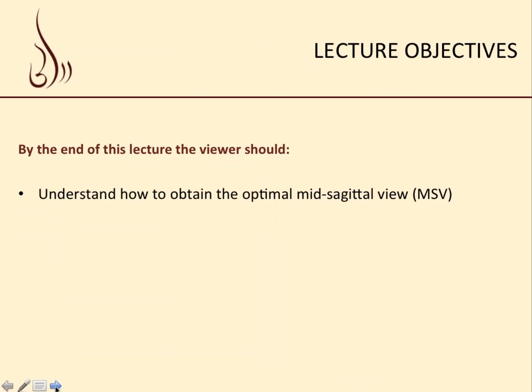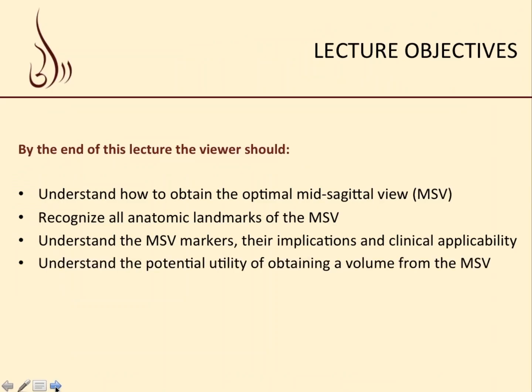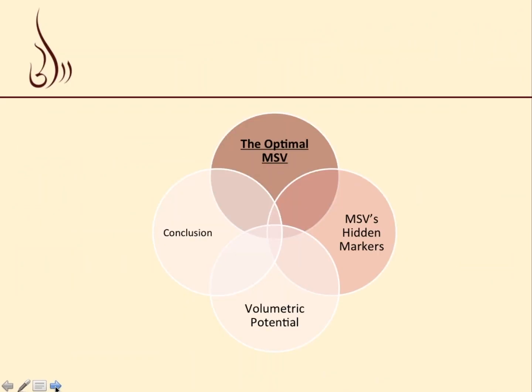Our objectives, we've already covered them. We're going to understand how to obtain the mid-sagittal view, the anatomic landmarks, talk about the various markers, their implications and clinical applicability, and finally the potential utility of obtaining a volume from the mid-sagittal view. We'll start with the optimal mid-sagittal view.